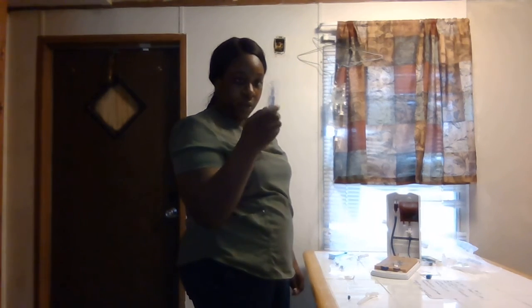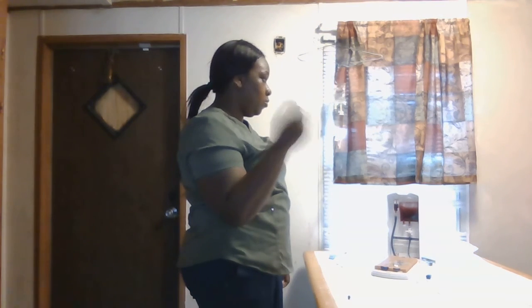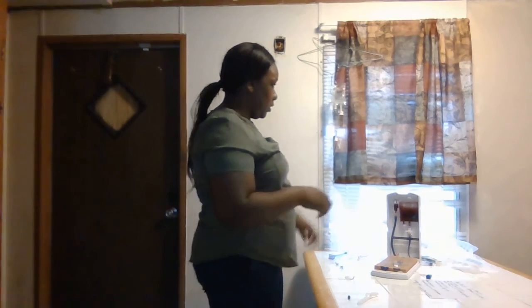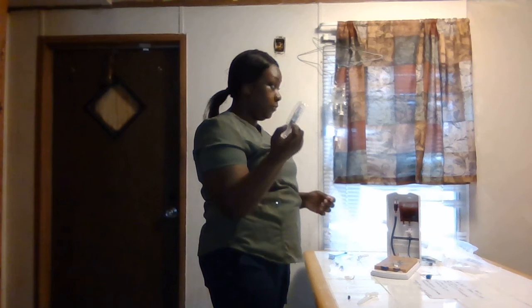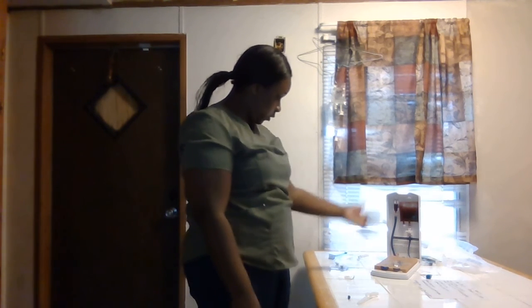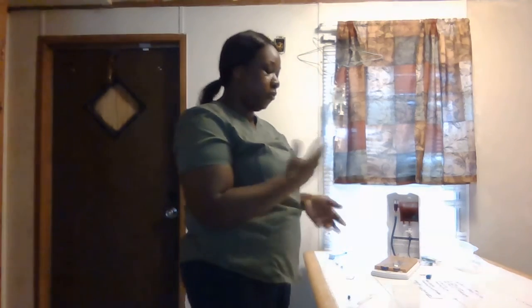But before we flush, we always push up so we can take the air out of the syringe. Once we remove the air of the flush, then I can again clean off my extension port, flush him, and secure the extension port. So now he's off to X-ray. Again, you always wash your hands and remove your gloves and wash your hands.